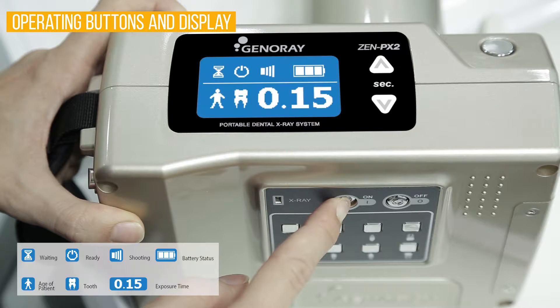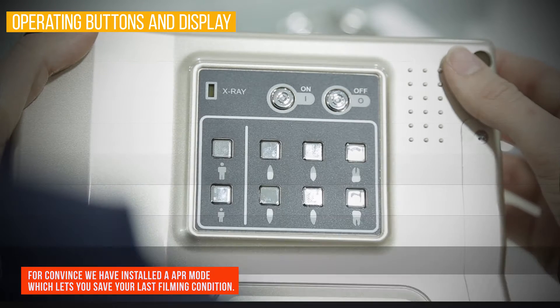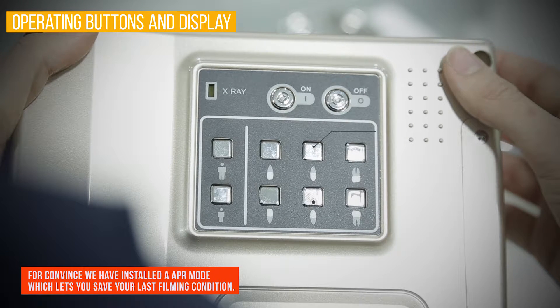Turn on power and check display. You can check X-ray exposure setting and operation status by checking the LCD screen. By using the preset button, you are able to do a patient setup and also able to pick out one of the six tools.